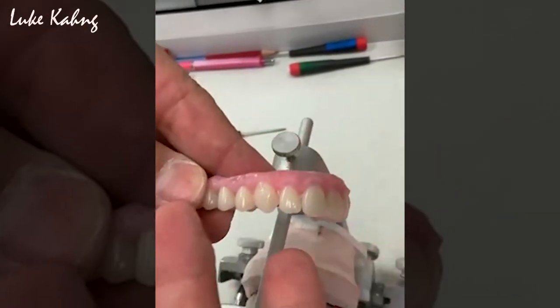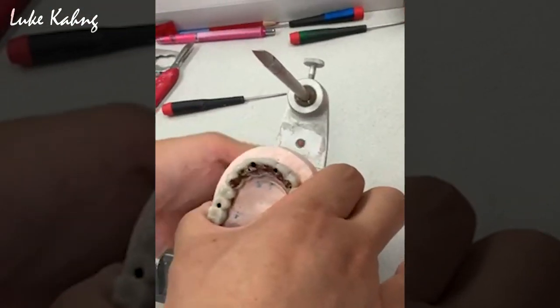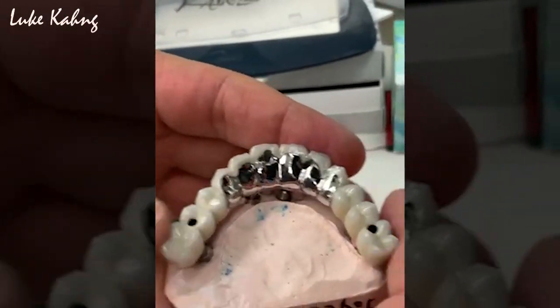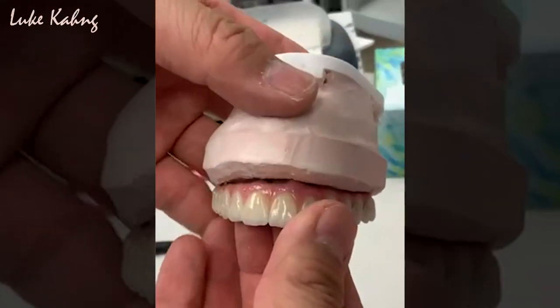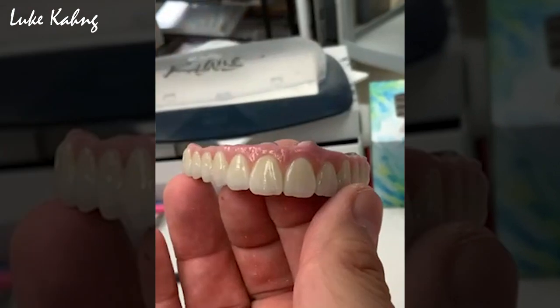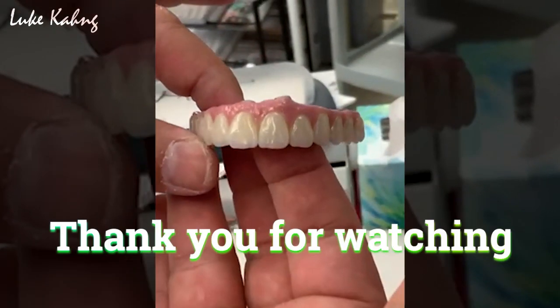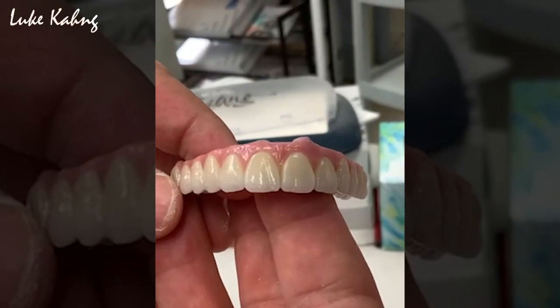So we finished it — the finals are nice. It's hard but we finished that one. Alright, so now the patient can make the top-of-the-line prosthetics. Alright, cool.